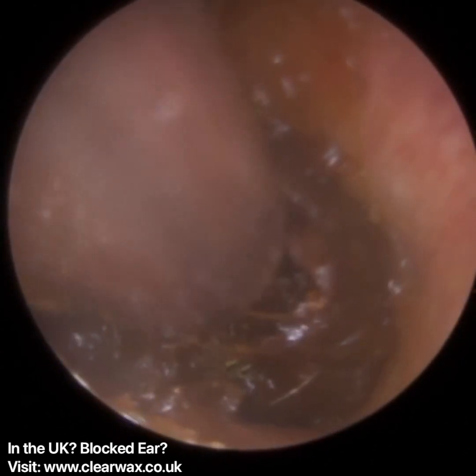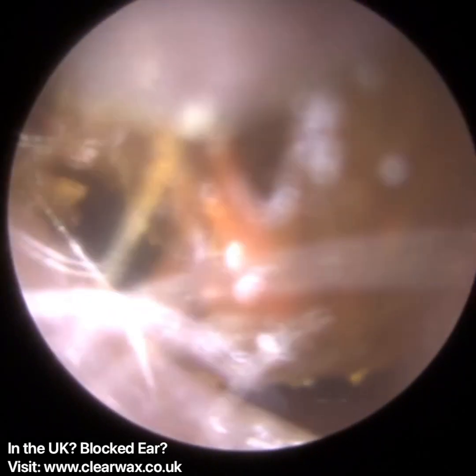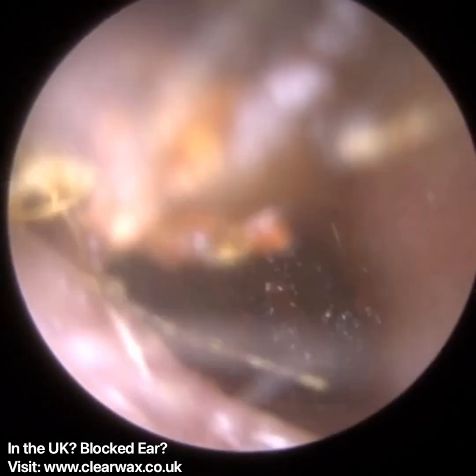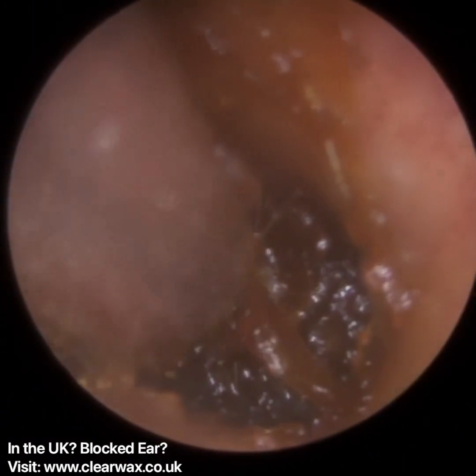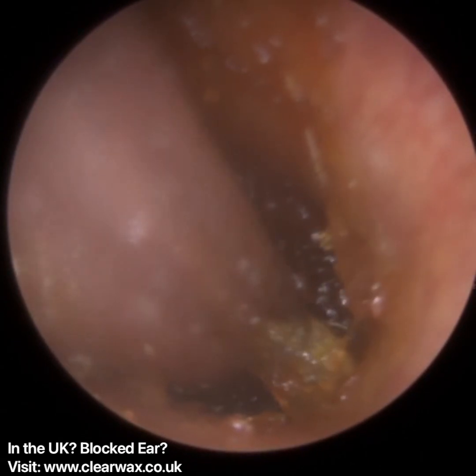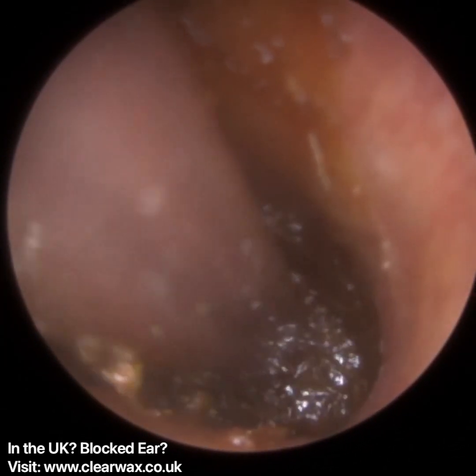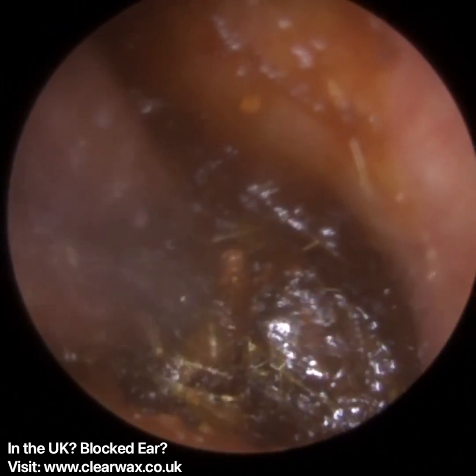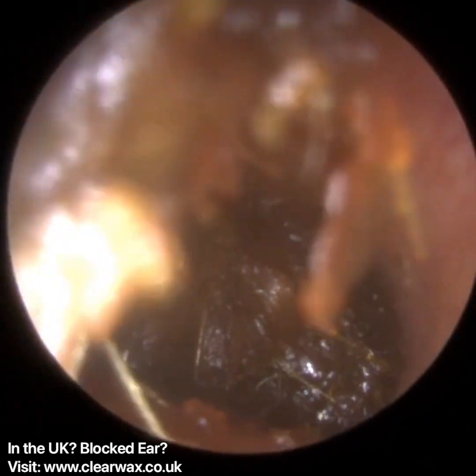The patient contacted ourselves, and again, we managed to get them in the same day as an emergency because they really were struggling, and it's been a few weeks that they were struggling with the wax. So we're just in the left ear here, and you saw the mid-canal was a bit narrow. With an endoscope, there's no issue, truth be told. Once you've acquired the skill and you've got the right training, there's no ear that you can't perform earwax removal in. And we're slowly just removing this soft wax.